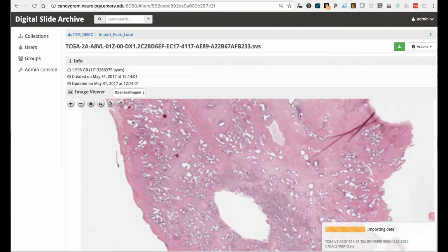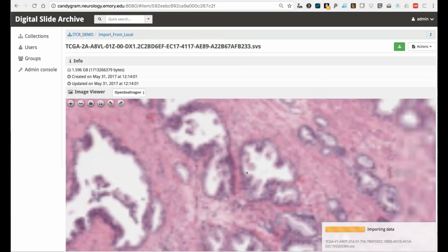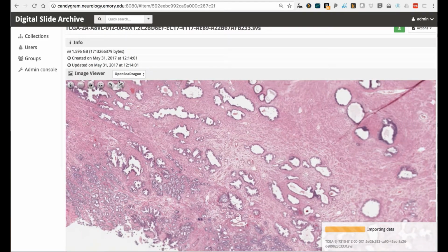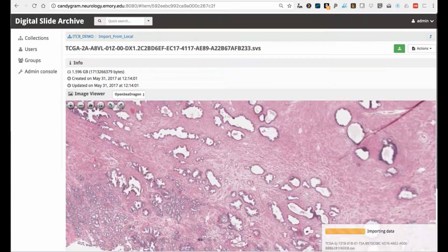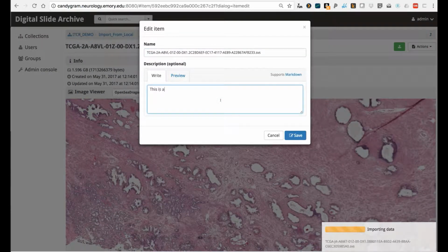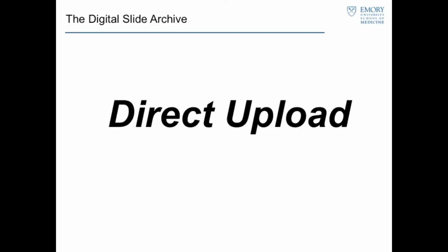These are then cached. So the first time you take a little bit of a performance hit, but then those things are cached. And even though I'm currently in the process of killing my file system, since I'm reading terabytes of data, the performance of the DSA platform itself actually isn't that bad.